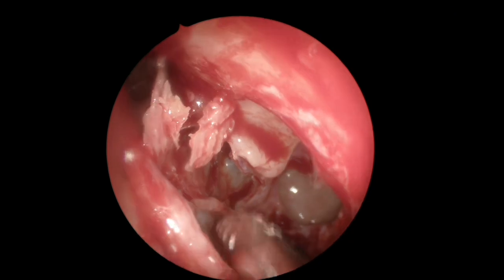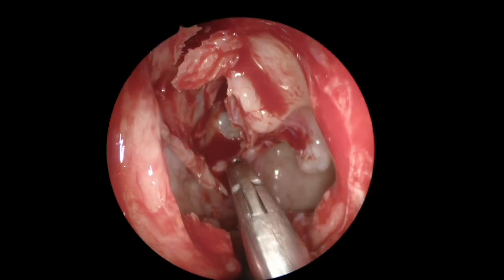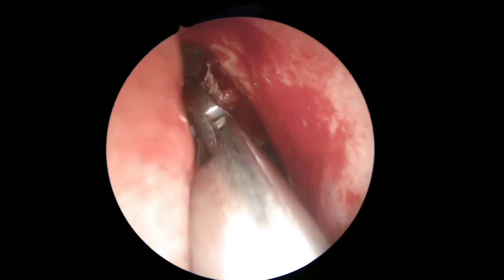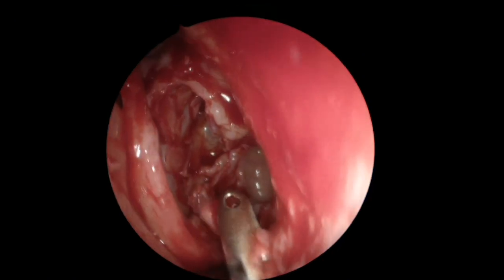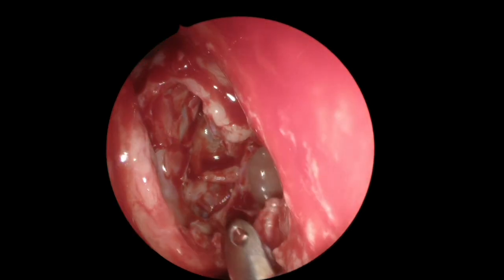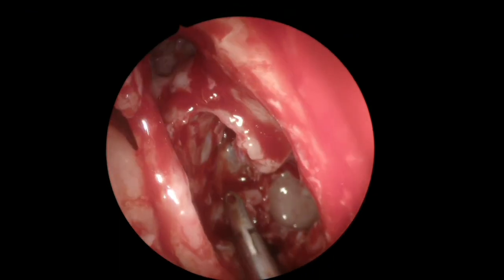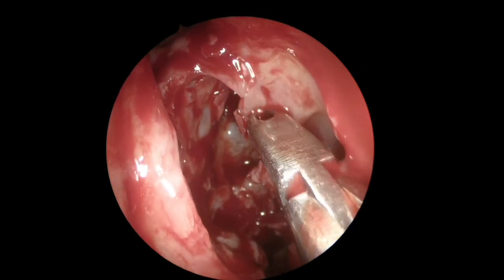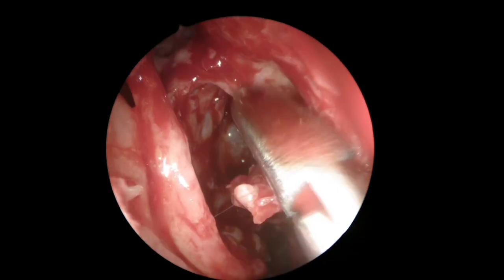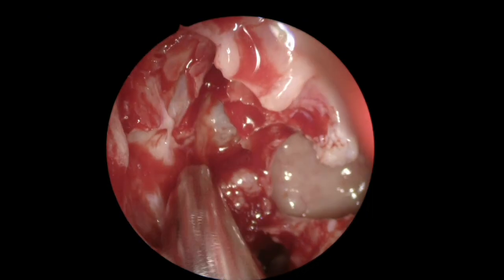I believe we've now opened most of the ethmoidal cells. At the bottom of the image you can see the third lamella — the basal lamella of the middle turbinate — with the descending process mostly at the level of the posterior wall of the maxillary sinus. That's the limit between the anterior and posterior ethmoid complex. Remember that the anterior ethmoid complex has about eight to ten small cells, while the posterior ethmoid complex has three to five larger cells.